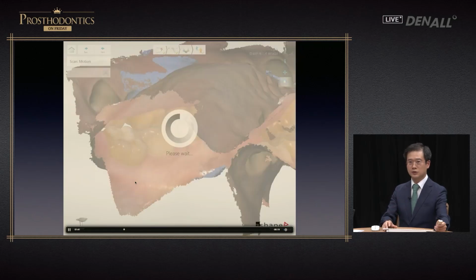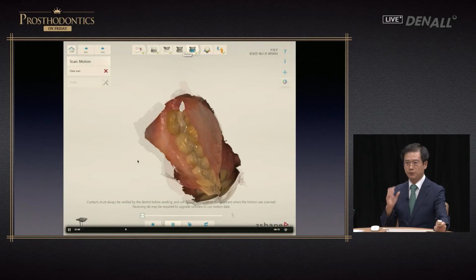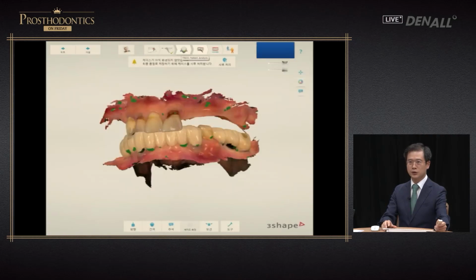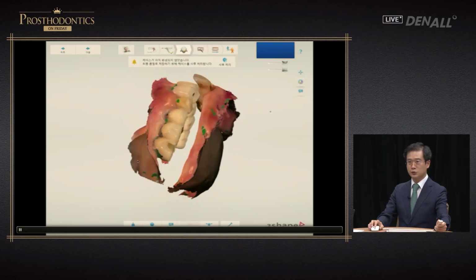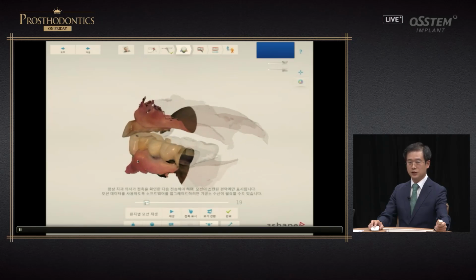I make sure that the computer does not make these calculations, and I accurately take the lateral bite with the patient's CO reflected. Another recommendation is, if you come across this kind of patient, how can you reproduce CR bite or CO on the oral scan? If we are able to reproduce this, we'll be able to provide a better prosthesis.